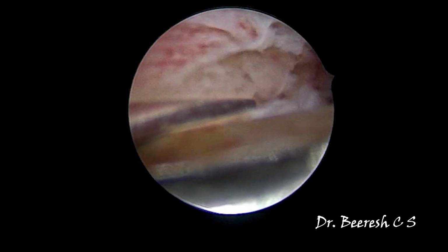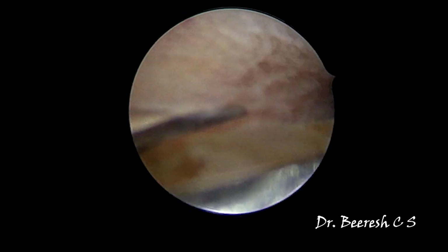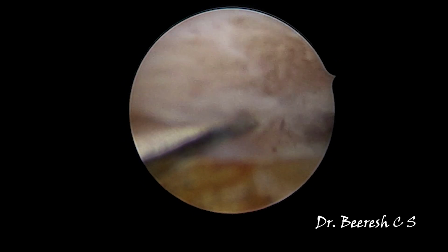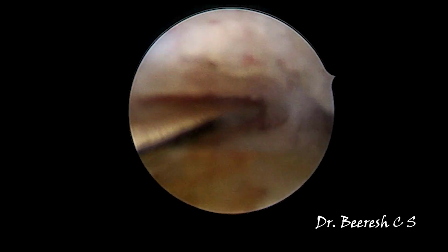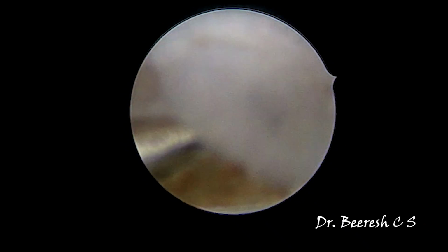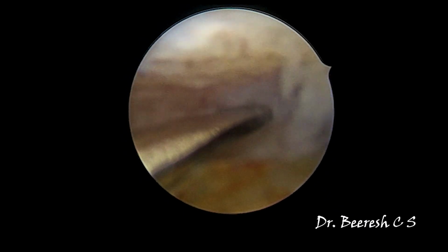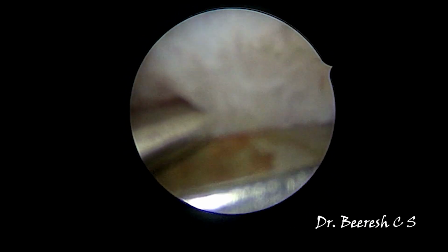Now I am planning to do a lateral metroplasty. For this I am insinuating the non-articulating or static jaw, keeping in line with the ostium, and then making small cuts millimeter by millimeter, and progressing my hysteroscope completely rather than just the scissors forwards.